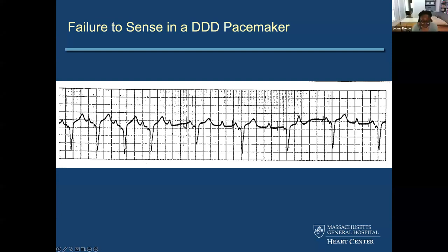And the next event that you have is atrial pacing with successful capture and ventricular pacing with successful capture. It's noteworthy that in this case, nowhere in the tracing do we see failure to capture where there's pacing that's actually delivered. What you see, though, is just the failure to sense, mostly to atrial events. And there's that one case where you have absence of ventricular pacing, even though there was no ventricular signal, and you would have expected that the device would have stepped in.